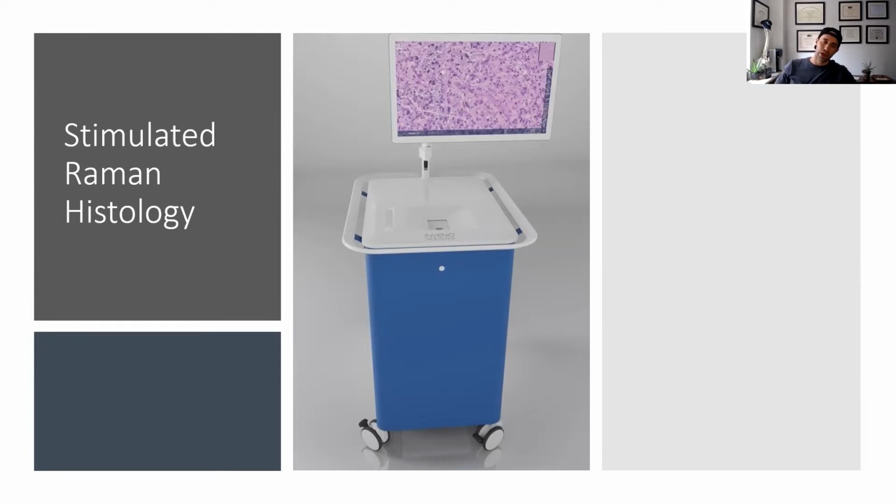You stop your surgery. If it's a low-grade glioma, you might just resect it aside and then decide not to do something. If it's a high-grade glioma, you may go for a gross total. You may do a supramarginal resection. And not only that, sometimes with the low-grade, as you get to those margins, I should say low-grade gliomas don't really fluoresce so well. So you really need your monitoring. You need your connectomics. You need your navigation.